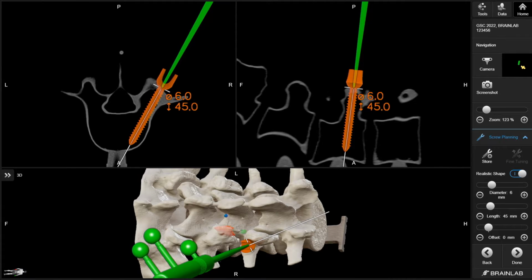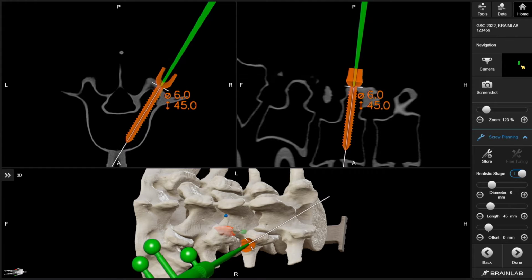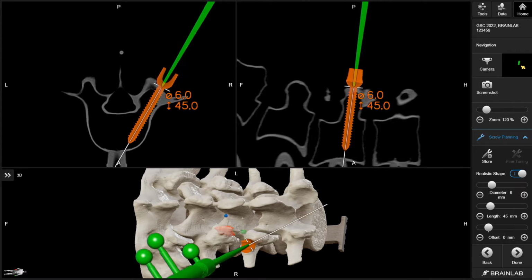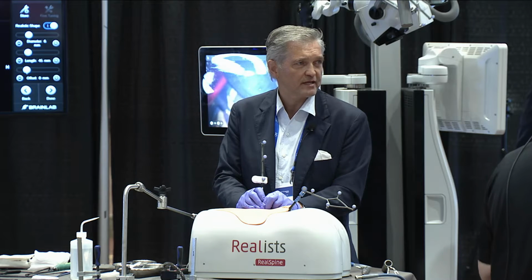Now I can pick a pedicle screw size. Let's do a 6045. So that would be nice, and you can drop the screw now and find it later. I don't like doing that. But for the size determination, this would be a nice time to do it. You can also do it preoperatively, obviously. You can look at your CT scan, MRI scan pre-op and pick your pedicle screws. You can also plan the trajectory like you would for robotic surgery. We just don't have to do that here because we use freehand navigation.